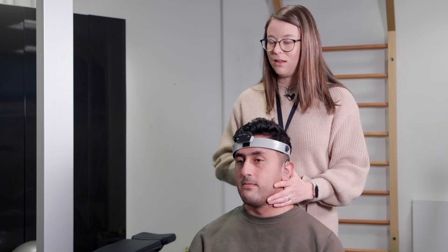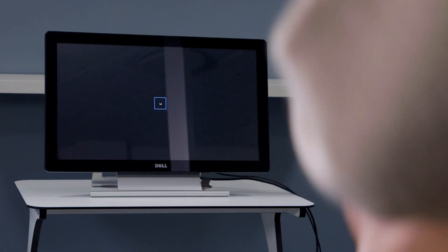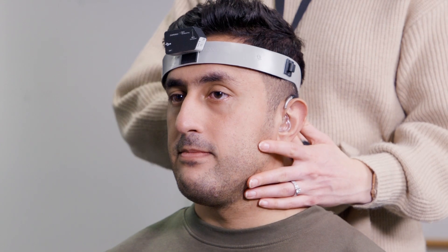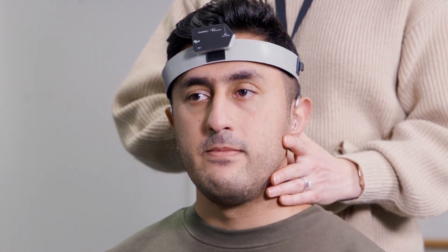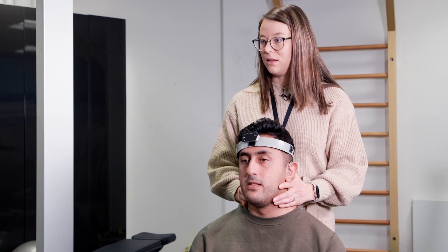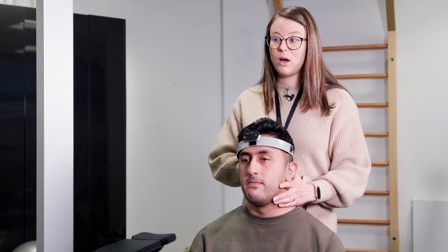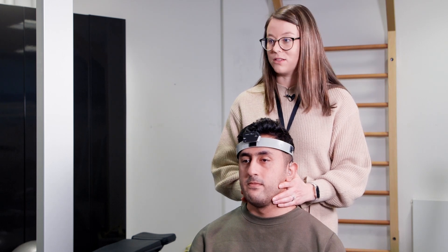So I'm going to place my hands right below his chin, my thumbs right behind his ears, and we're going to do quick head impulses that are randomized left and right directions. So here we go. And he's seeing the optotype change directions on the screen. And I'm inputting the response on the remote. And if he doesn't know the answer, he can always say, I don't know.